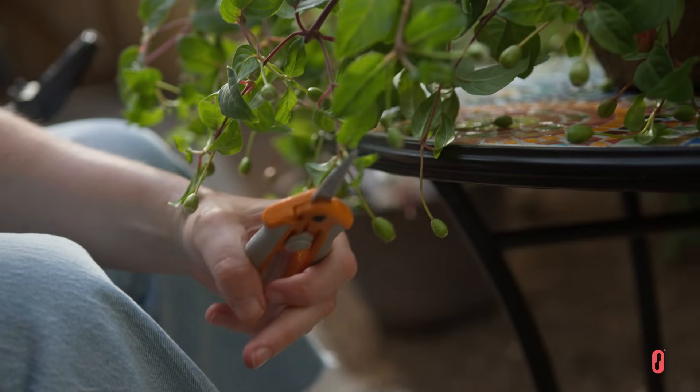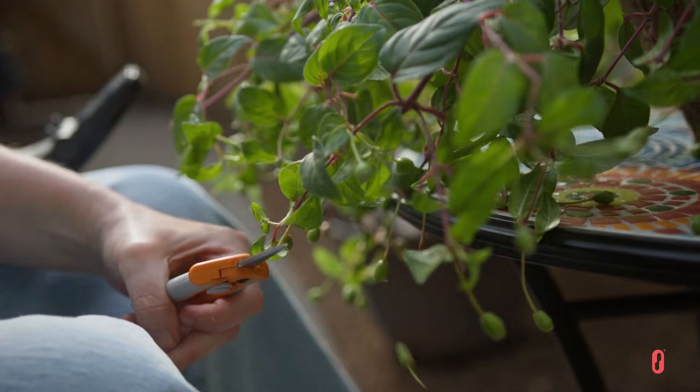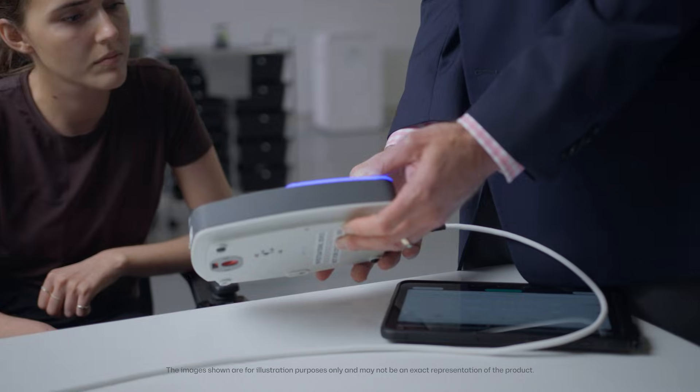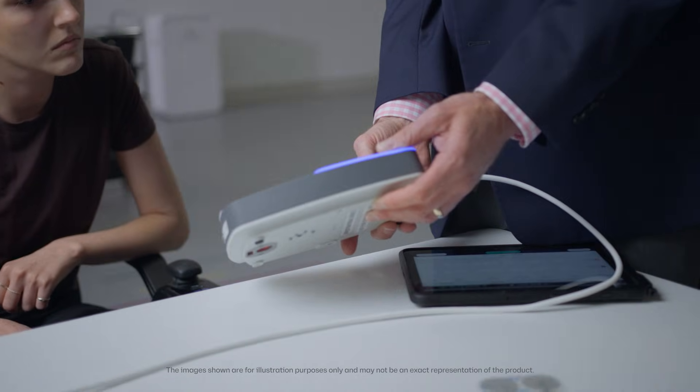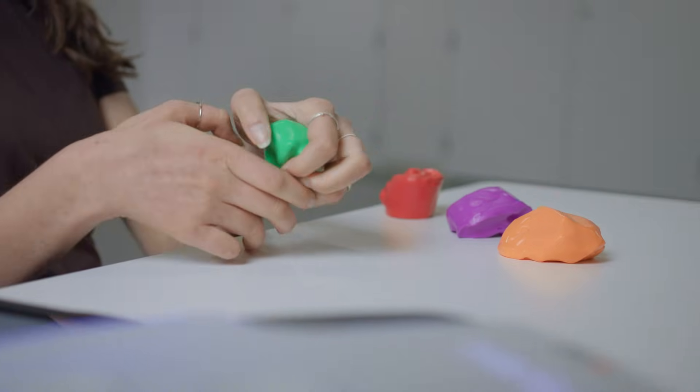The system is designed to be used while you're practising daily activities using your arms and hands. During rehabilitation sessions in the clinic, your healthcare provider will personalise the stimulation settings to your individual goals, which may take a few sessions.